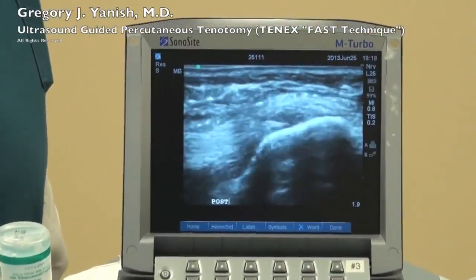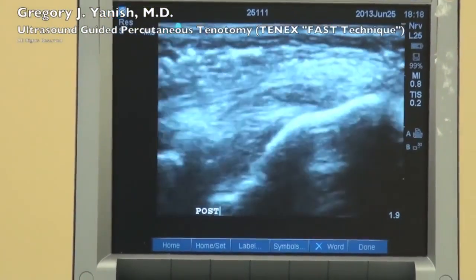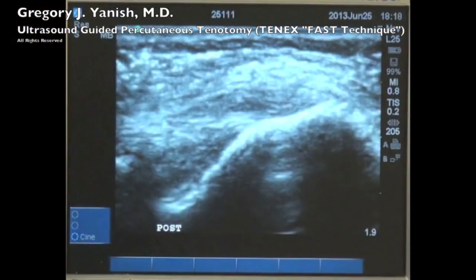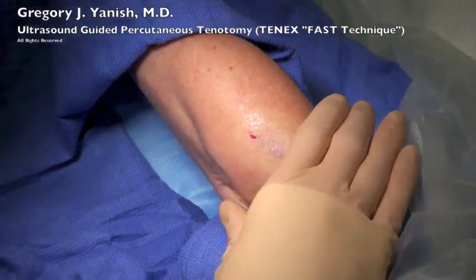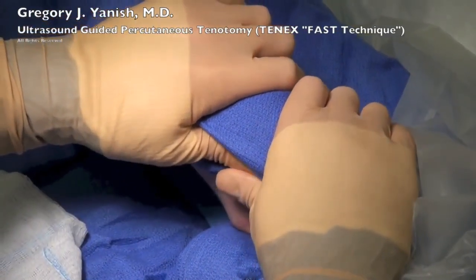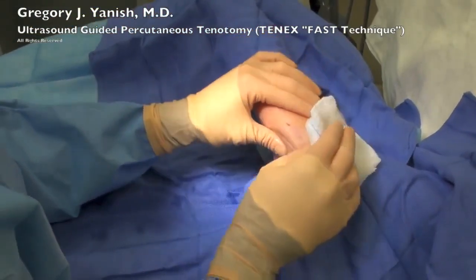Now taking a look at the ultrasound. The area that was once visualized as dark black or hypoechoic is nearly completely removed. There's a very small shadow in this area, and you can see that the tear has been very effectively removed. At this point I apply a little pressure and squeeze out some of the irrigation fluid that was instilled using the Tenex probe.